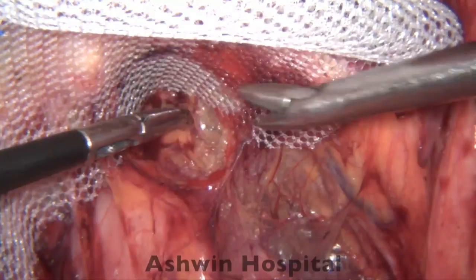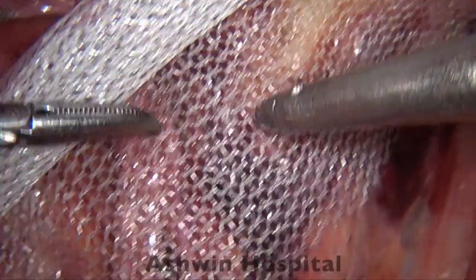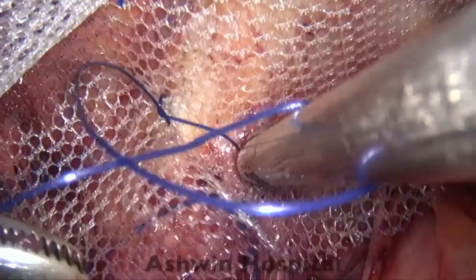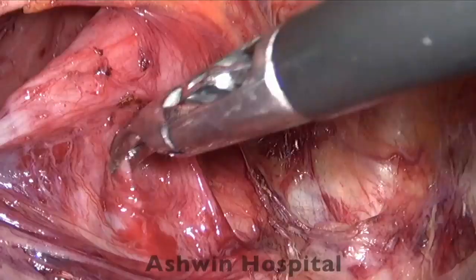So here you can see we have crossed the midline by at least a couple of centimeters, 2 to 3 centimeters below the level of the pubis. Because it was a large hernia on one side, we are just anchoring the mesh. Mesh anchoring is either based on your principles and how you practice, or in cases when there is a very large direct hernia, in order to avoid the mesh from prolapsing inside, then we can definitely anchor it.